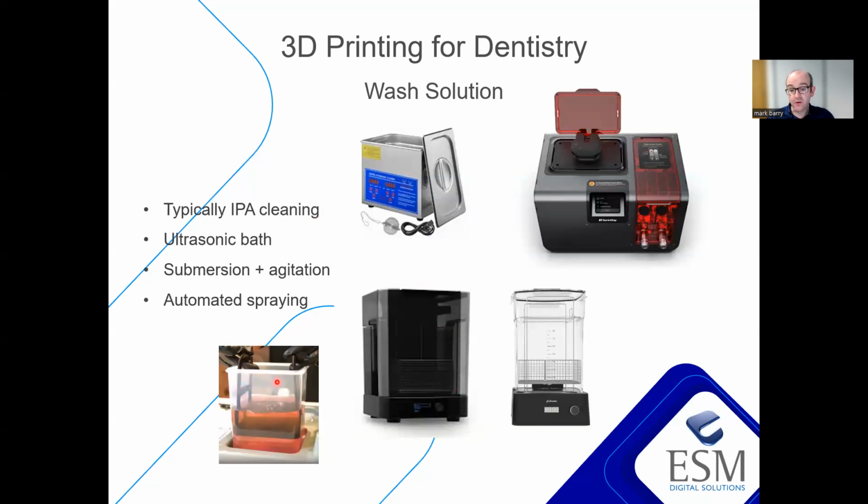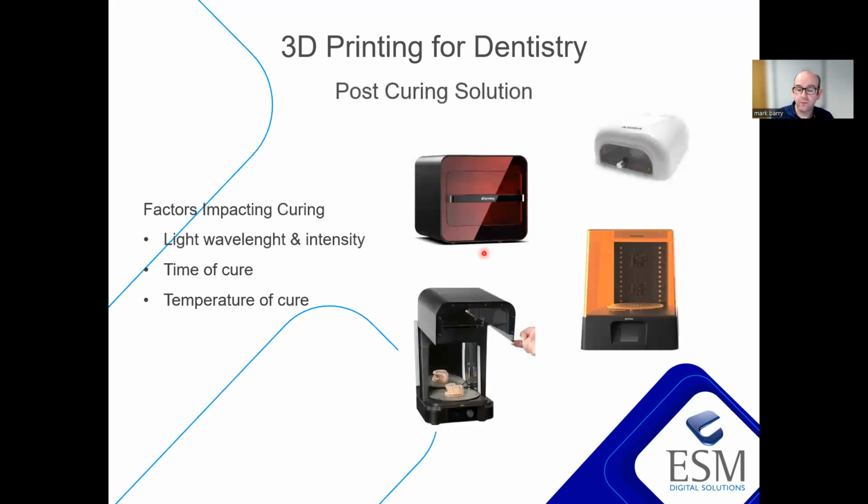Traditionally, it was just a bucket where the parts were put in and manually agitated. Sometimes we use an ultrasonic bath. SprintRay have an automated washing unit. Lots of different solutions out there. It's important that the parts are washed appropriately and clean. All of that uncured resin needs to be removed.